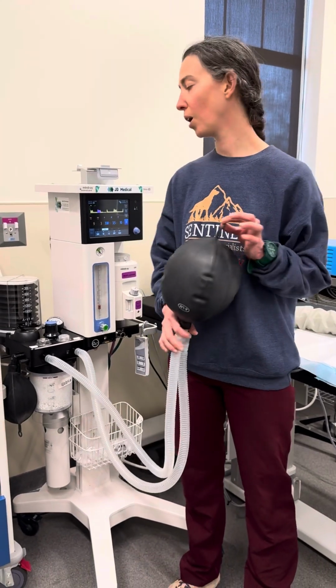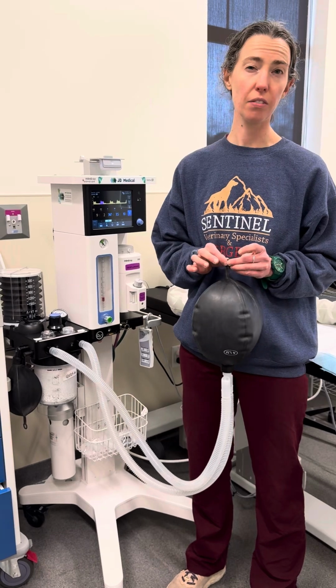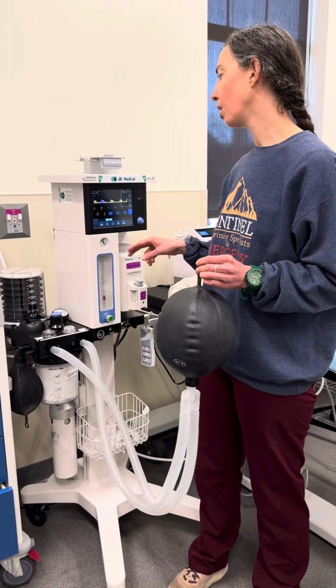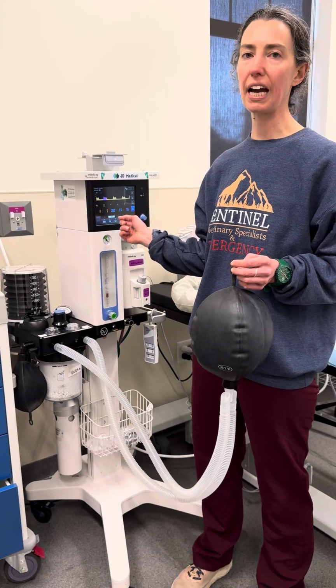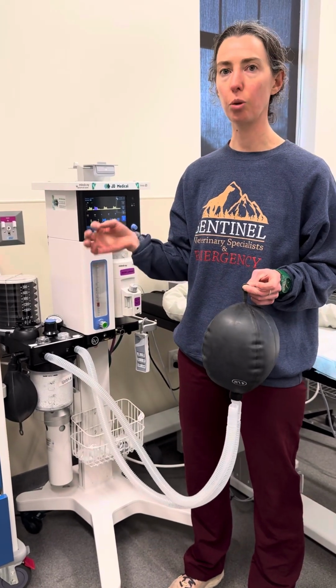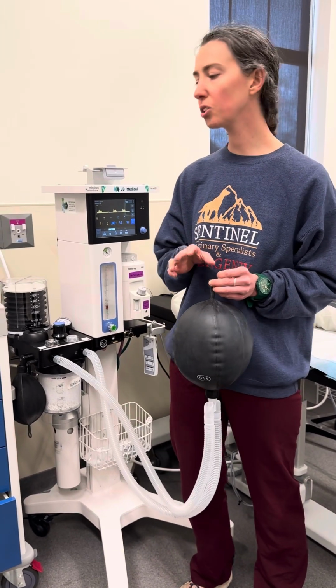All right, so we're going to talk about all 4 ventilation modes of the Veta 5, but we're going to particularly focus on the first 2. The first one says VS, which is volume support, and the second one says VCV, which is volume control ventilation. Those are going to be the 2 modes that we primarily use.